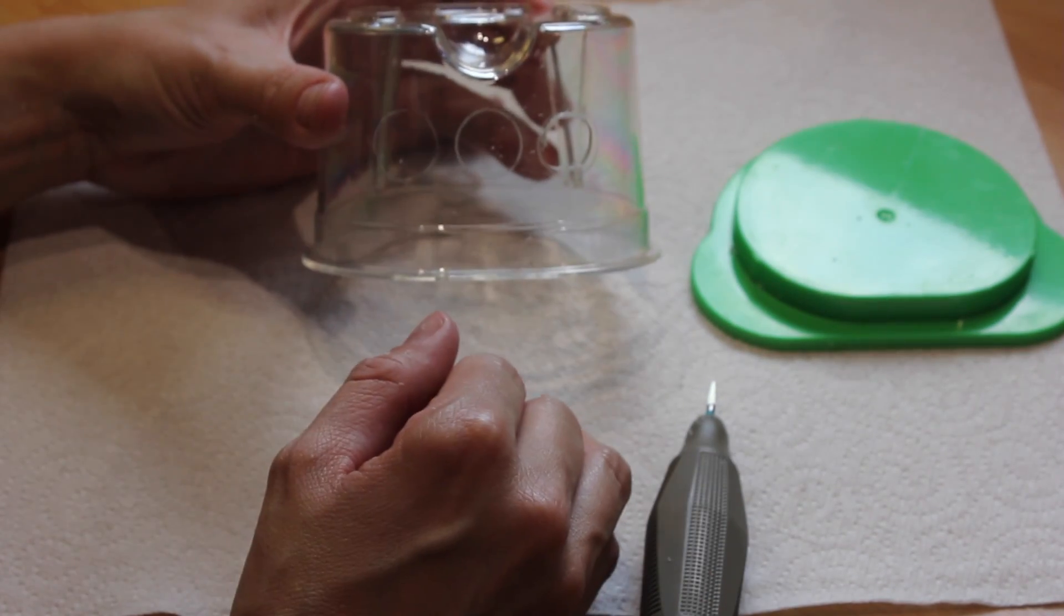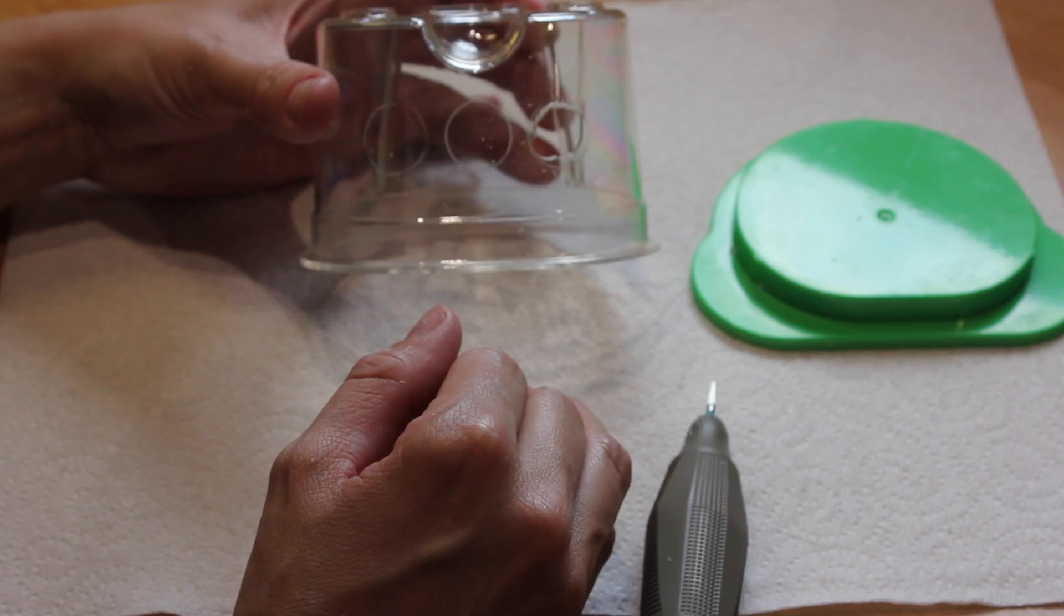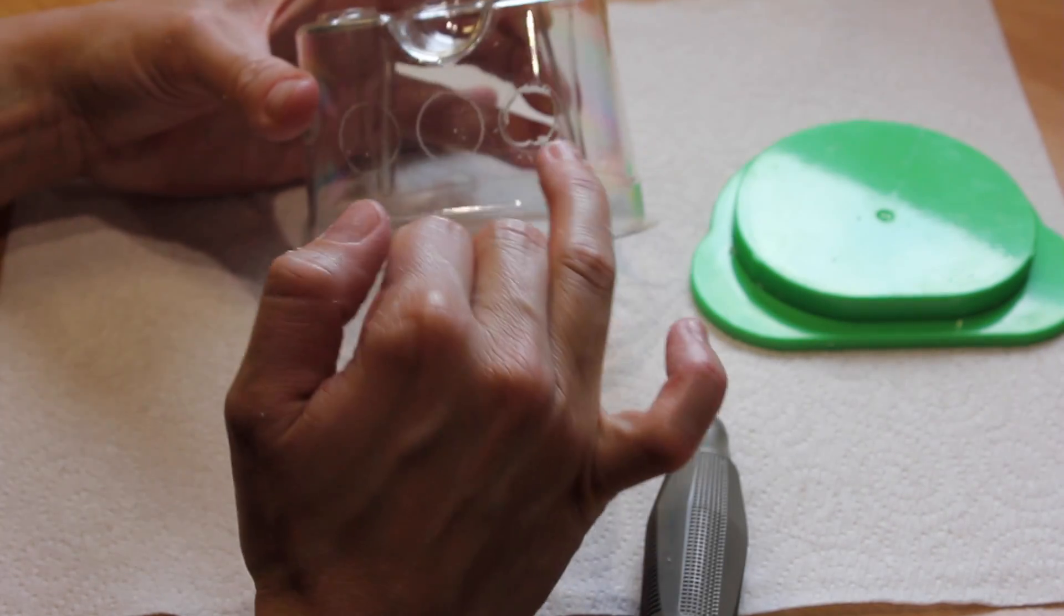Do the same with the other two and then transfer to a larger acrylic burr to smooth out the holes and take them right to the line.